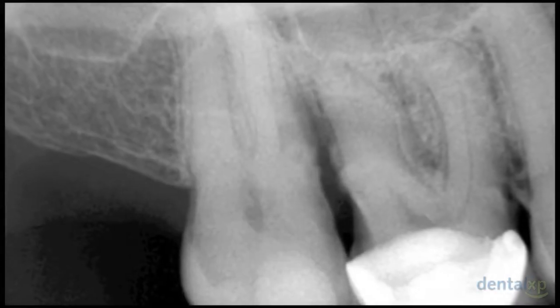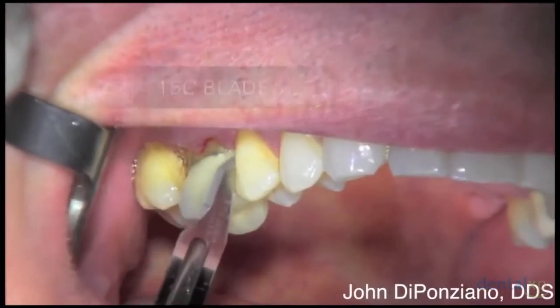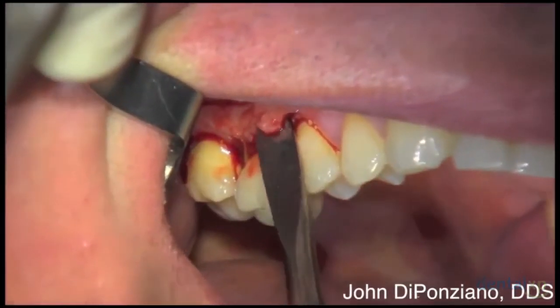This is a maxillary right first molar with a nine millimeter pocket on the distal facial root and furcation involvement. We're going to extract this tooth first, using a 15c blade to go around the PDL a couple of millimeters, buccal and lingual.